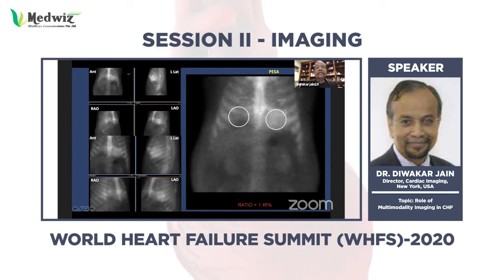This is a 93-year-old male who presented with recurrent bouts of diastolic heart failure, and he was suspected to have senile amyloidosis of the heart, which was confirmed by technetium pyrophosphate imaging. There is intense uptake, but less intense compared to the last patient. This would be grade 2 uptake, and the ratio turned out to be 1.45.